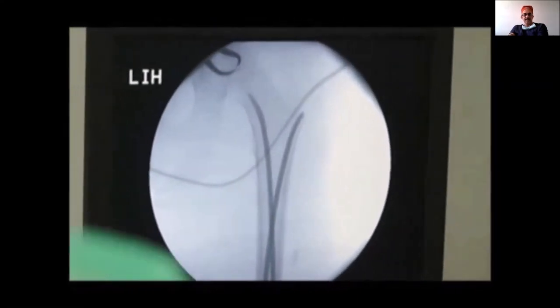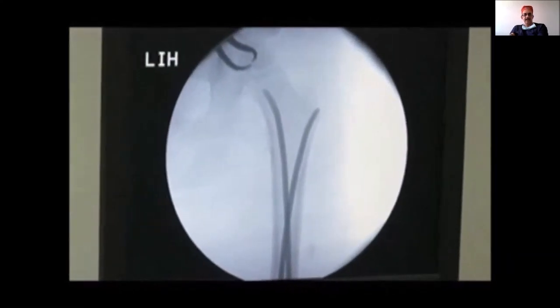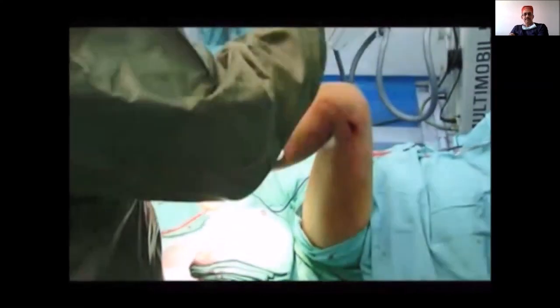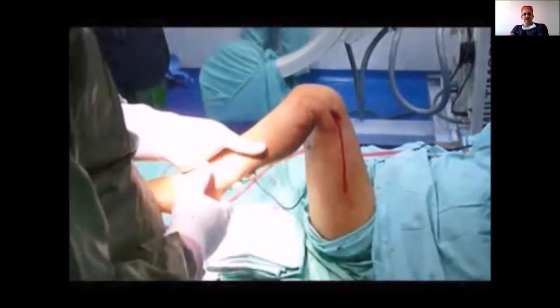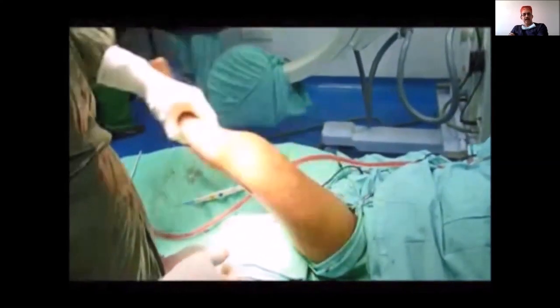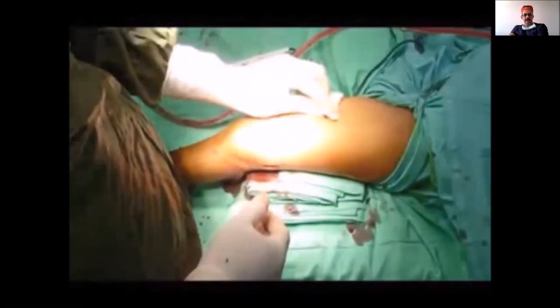The final step is flexing the knee — especially in a transverse fracture — and a gentle pump on the patella to cause a little compression. Always check rotations; they must be equal. A malrotational reduction can cause an abnormal gait pattern in a child, so check version carefully. Once done, take subcuticular sutures and apply a gamgee dressing with a crepe bandage.